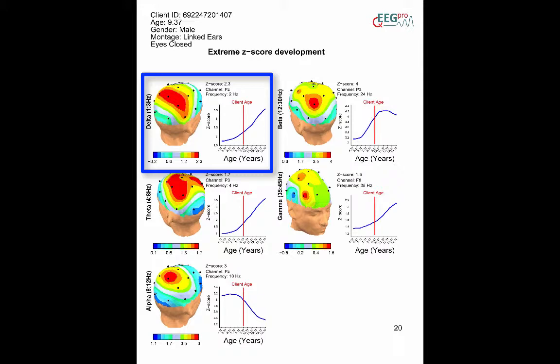The three-dimensional plot is scaled between the minimum and maximum z-score within that particular frequency bin. This plot can serve as a tool to locate the hot spot or cold spot of deviant activity.